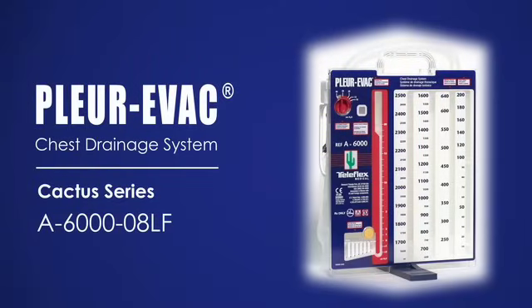The Plurivac A6000-08LF Adult Pediatric Chest Drainage Unit is a sterile, non-pyrogenic unit intended for single patient use only.